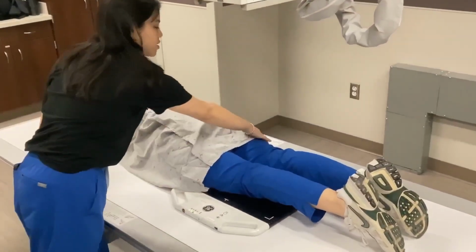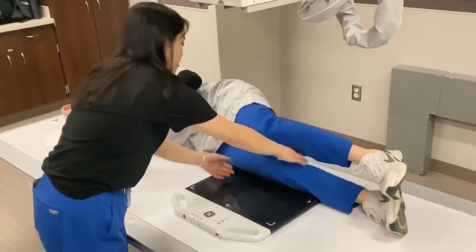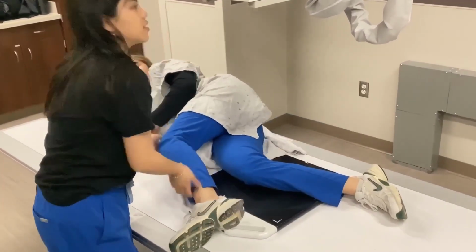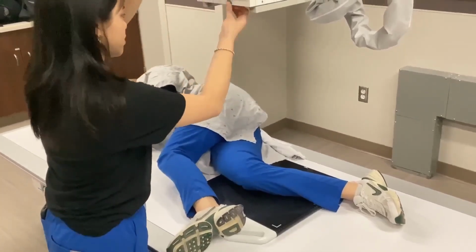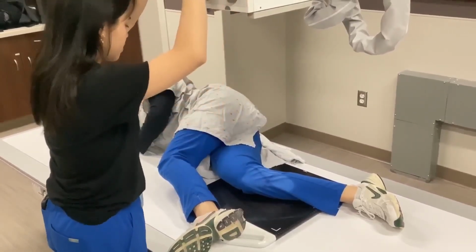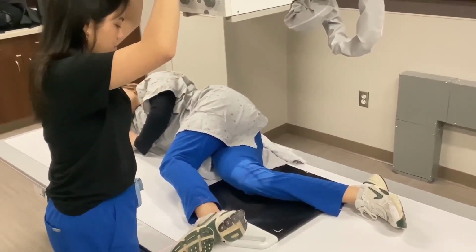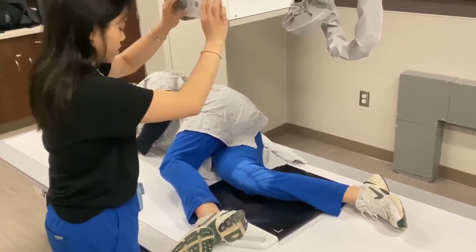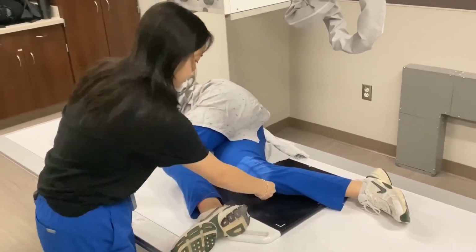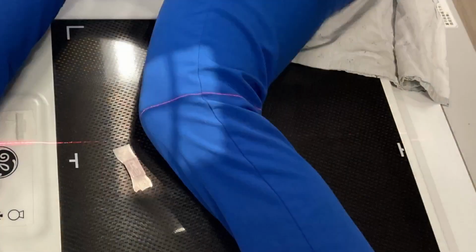You're to instruct the patient to lay in a lateral recumbent position with the affected side down and flexing the knee 5 to 10 degrees to prevent patellar displacement. Ensure there is a 40-inch SID. For this position, the patella is positioned perpendicular to the IR with the femoral condyles superimposed. The CR is perpendicular and centered to the mid-patella, and no shielding is used per department protocol. Ensure that you mark the affected knee and collimate to include the patella and distal femur.